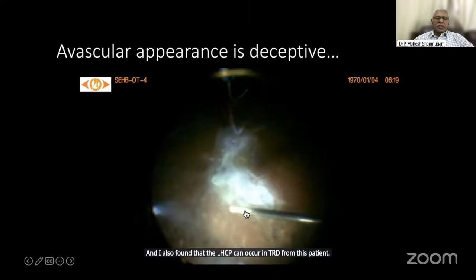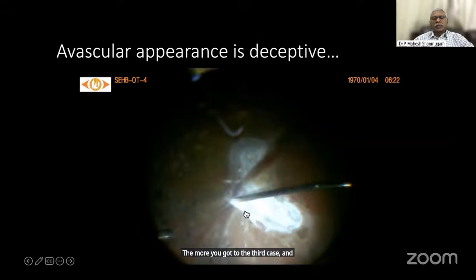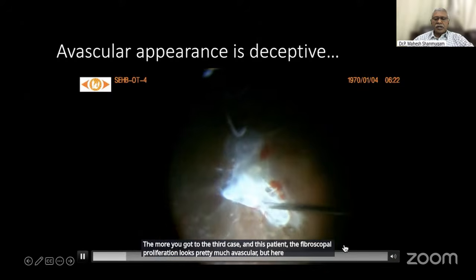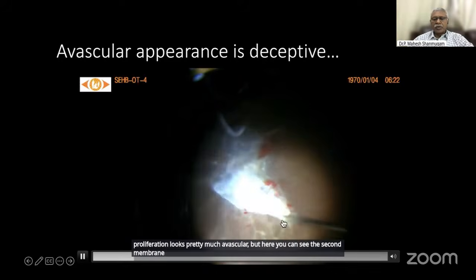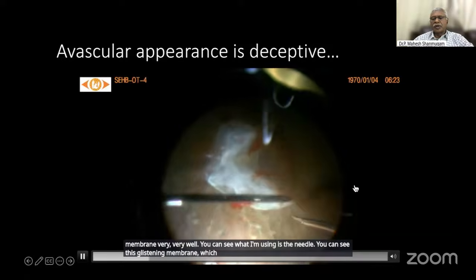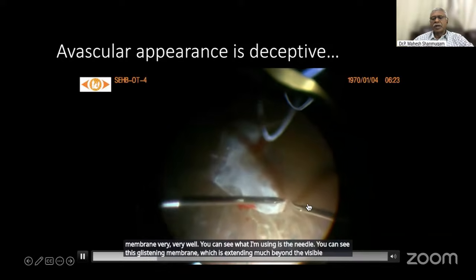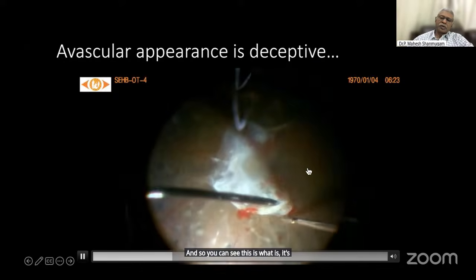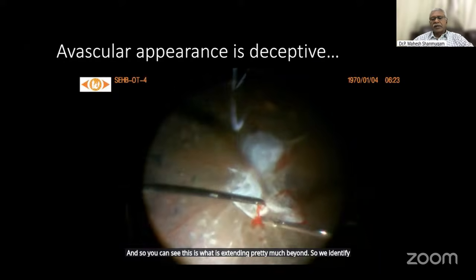So moving on to the third case, and in this patient, the fibrovascular proliferation looks pretty much avascular, but here you can see the second membrane very, very well. You can see what I'm using is the needle. You can see this glistening membrane, which is extending much beyond the visible fibrous tissue, is the second membrane. And so you can see it's extending pretty much beyond. So we identify that, then lift it up.